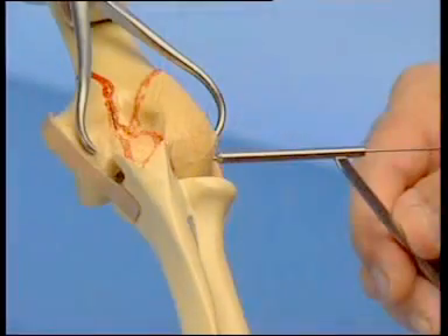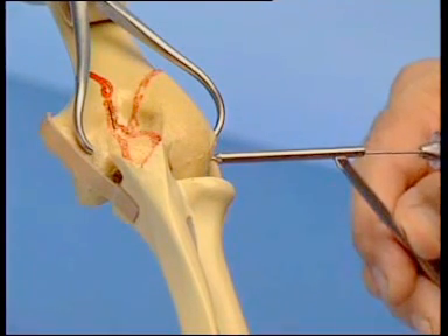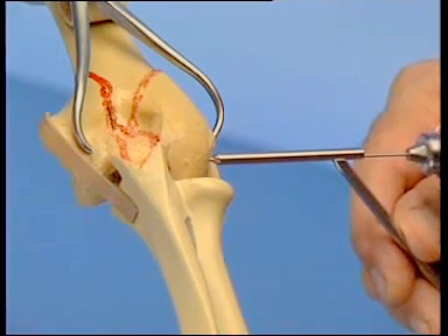The threaded K wire, which can also serve as a reduction aid, is now drilled in the reverse direction outside-in, all across the three articular fragments.